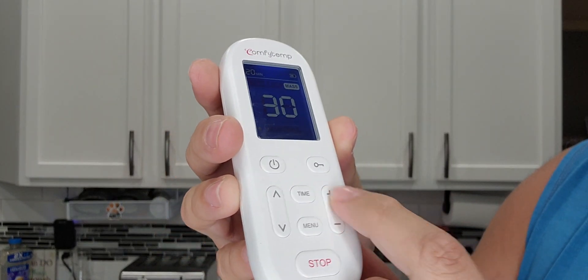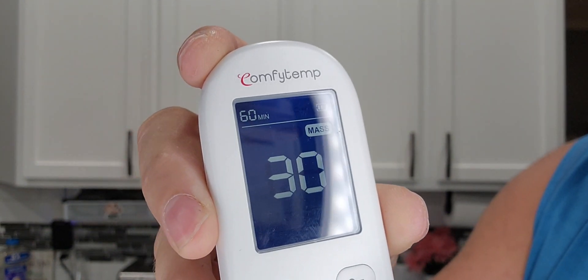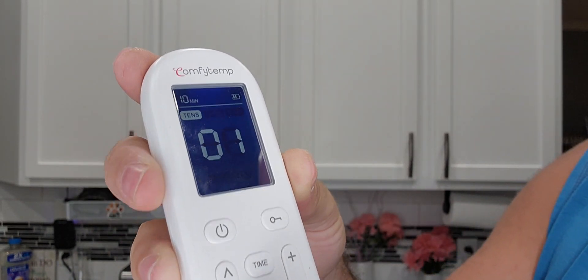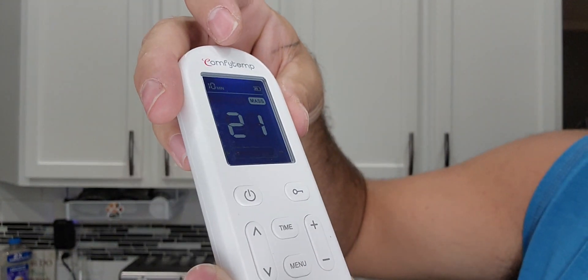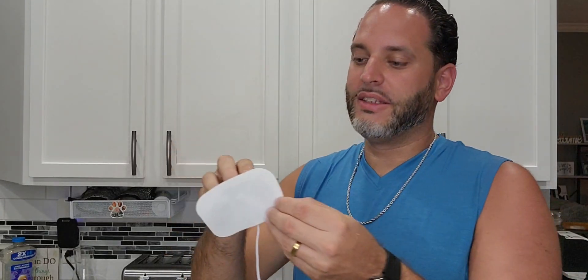Right here you have your intensity — your plus and minus. You can set a timer, so in that top corner you can see how the timer goes all the way up to 60 minutes and a minimum of 10 minutes. Then you have your menu button so you can use it as a TENS, EMS, or massage mode. And then you have your stop button.